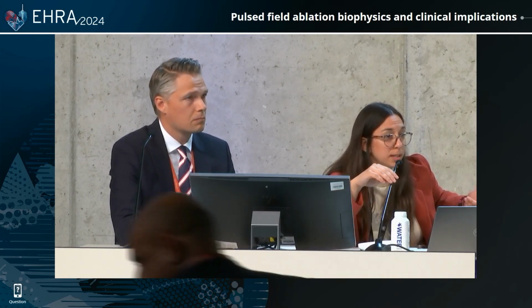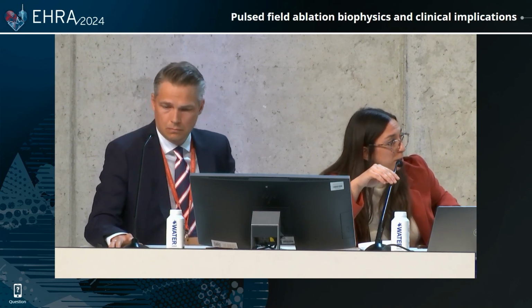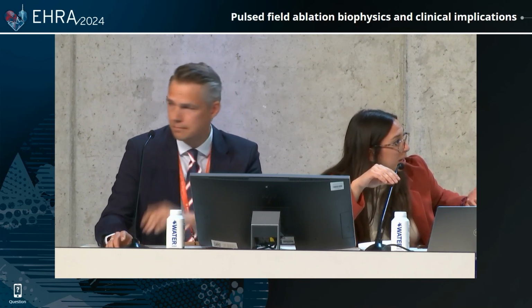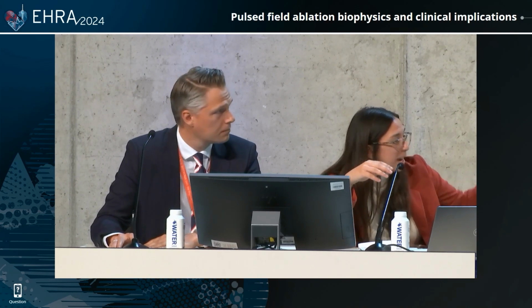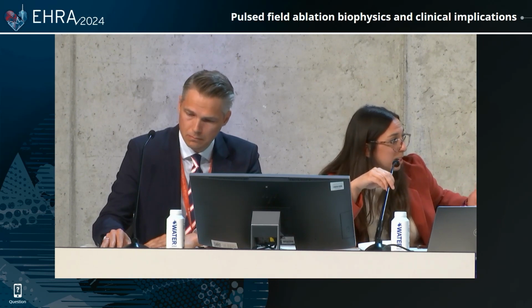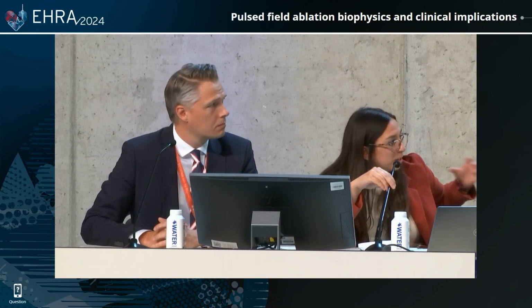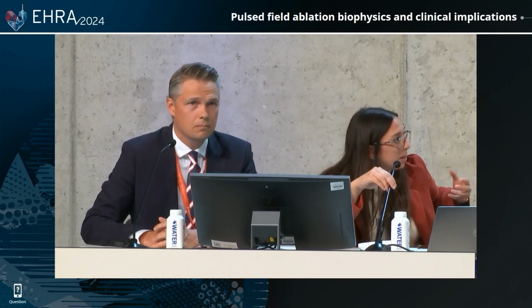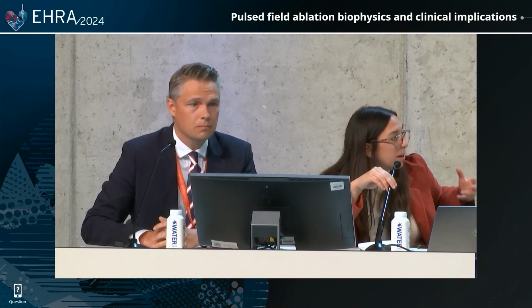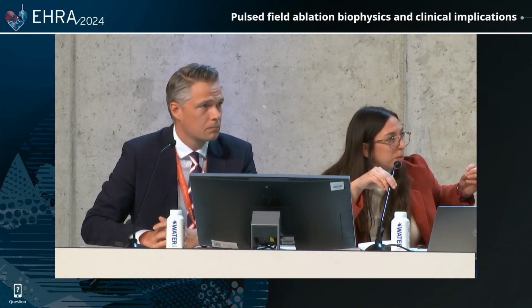And then also about the applications, the number we should give. Yesterday there was a presentation, a sub-study of the INSPIRE trial, where they showed that more applications led to a better outcome. But before, when I read the first draft of the study, I wasn't sure how many applications you have to give. So you say different designs, different applications, but I think it needs to be investigated invasively to really know, because as you said, there is myocardial stunning. Nothing guides your ablation anymore. As Daniel also said, it's not on us to decide the dosing protocol anymore. So we need clear instructions on how many applications to durably isolate a vein.